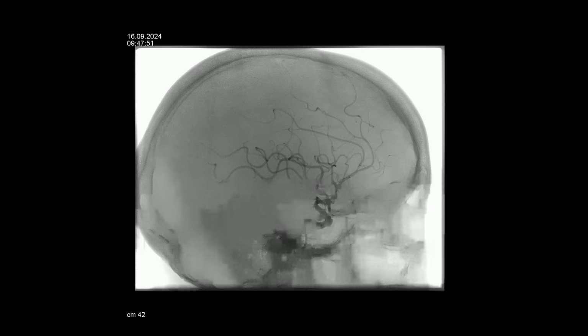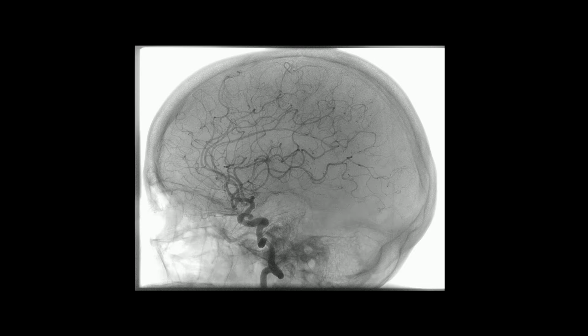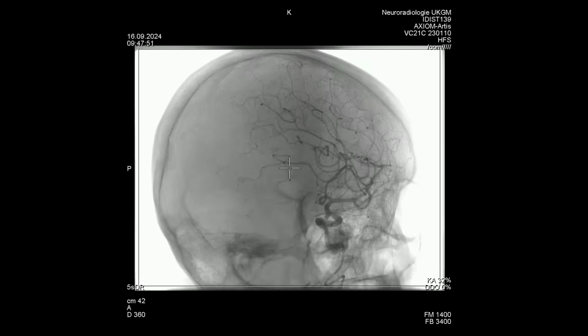And here's the 3D angiogram, and you can see here our saccular aneurysm of the left ICA.